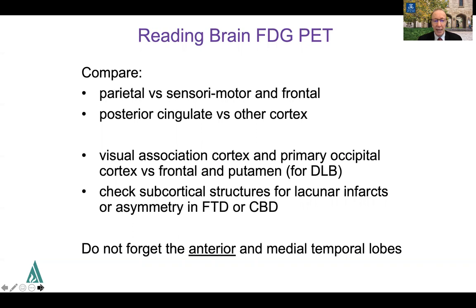Don't forget to look specifically at the anterior and medial temporal lobes. The anterior temporal lobes are involved in semantic dementia, a form of FTD. The medial temporal lobes are particularly reduced in LATE. Interestingly, they're somewhat spared in Alzheimer's disease despite the emphasis on hippocampal atrophy — paradoxically in more advanced Alzheimer's disease you see greater hypometabolism in the lateral temporal cortex than in the medial temporal cortex.